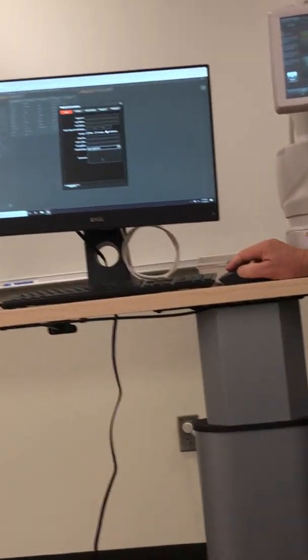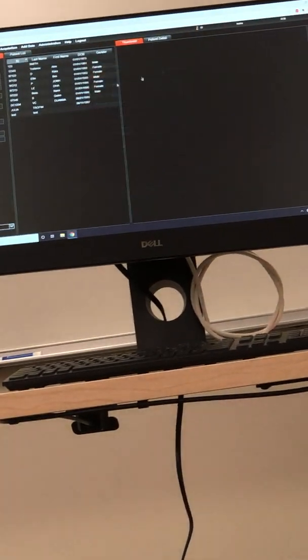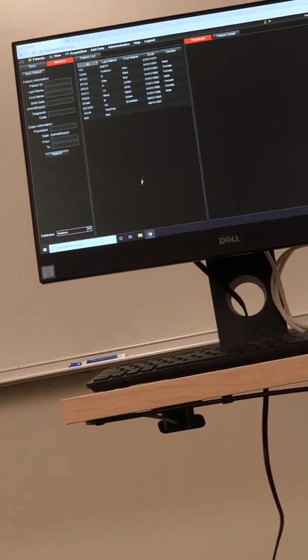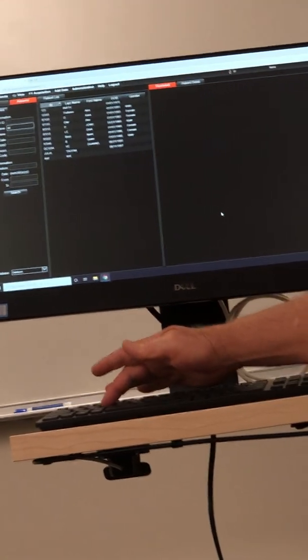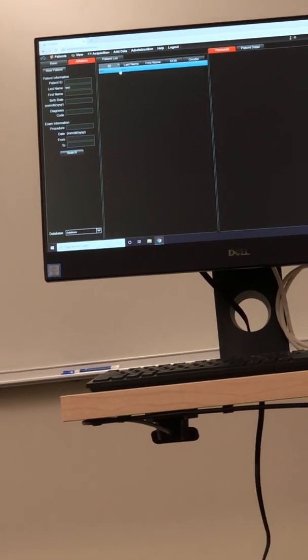Okay. Good. And then gender is important too, because that all applies to the normative value, which now is called reference data. So now to choose an existing patient, this is a list alphabetically of all the patients that are in there. Obviously that's going to grow. So to find a patient, you can put their ID in there or their name. Last name, Test, for instance. You do search, and it's going to isolate that one patient. So it makes it pretty easy.